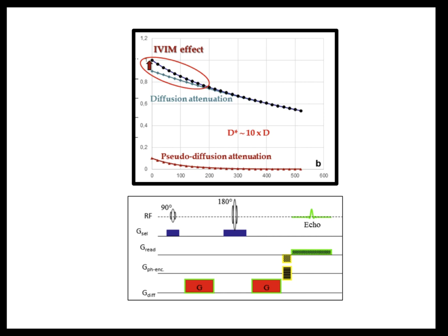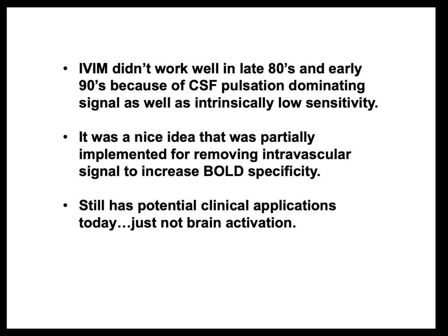It turns out that this technique is extremely sensitive to all pulsating, moving things. So it included motion as well as CSF. And plus, it has extremely low sensitivity. So it really didn't work at all. And he even says that in his most recent paper. But it really has other uses in other parts of the body that don't have pulsating CSF. So it's potentially very useful. So it didn't work in the late 80s and early 90s.